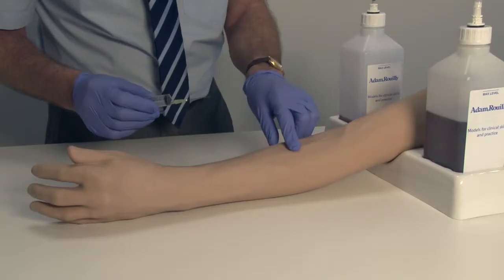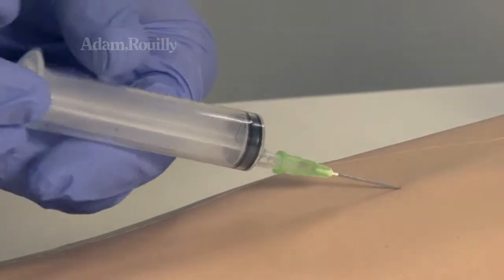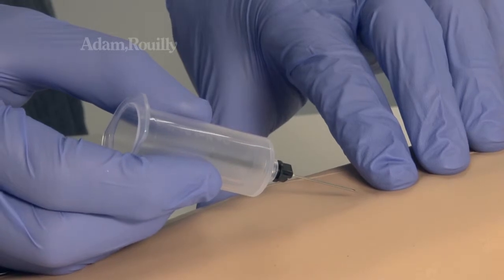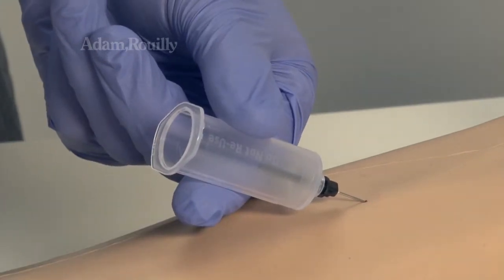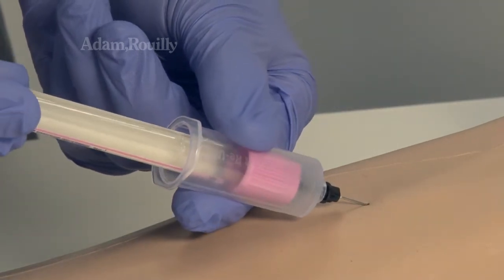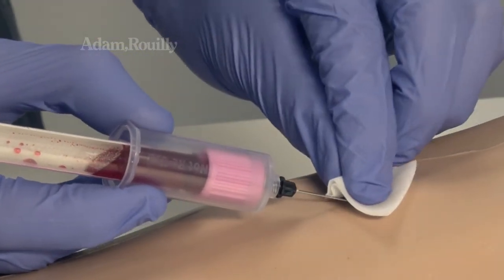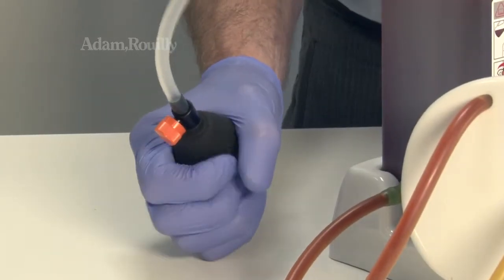During use: A range of vascular access devices may be used. The arm's highly realistic flashback sensation makes use of syringes or vacutainers near lifelike. Maintain optimal pressure during use by periodically pumping the bulb.